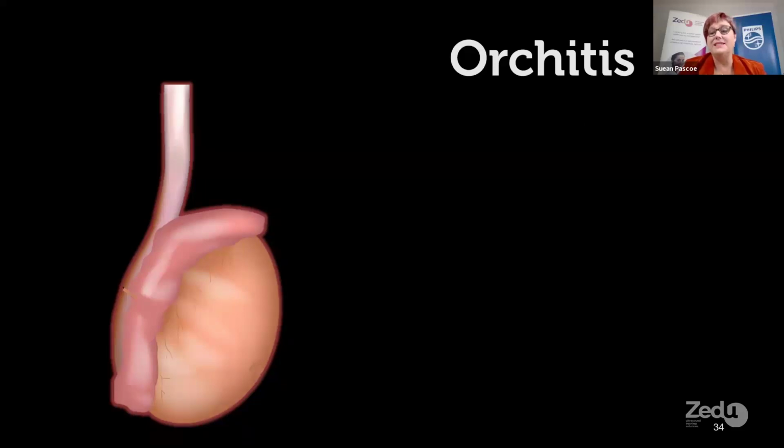So the best thing that you can be doing, even if all you did was look at the B mode findings, you're looking at size, you're looking at the echo texture and the echogenicity, and yeah, pop the color on to compare the flow, but it's not the be all and end all, and I wouldn't be hanging your hat on it. I still think that your clinical skills are probably going to be much better at it than your color skills for a long, long time. So you don't want to go overcalling or undercalling and just hanging your hat on the Doppler scan, because I think it would be risky.